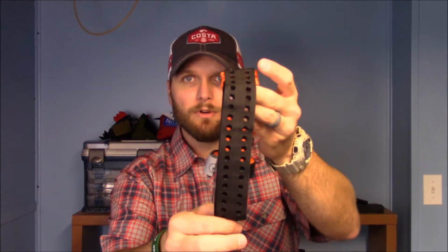And this one's a little bit different. So as you can see, at first glance, it looks kind of like a cat tourniquet. But the thing that's different about this is the Velcro is not very strong at all. This would not hold a tourniquet in place and allow adequate pressure to be put on an extremity. You see there's a double row of holes there that run through the entire length of the Velcro. And what that's designed for is, if I can show you, this little device here is what makes this thing so unique and so, I think, relevant in the tourniquet game.